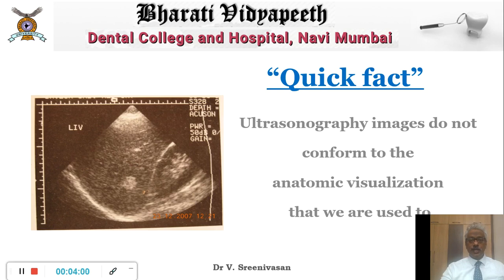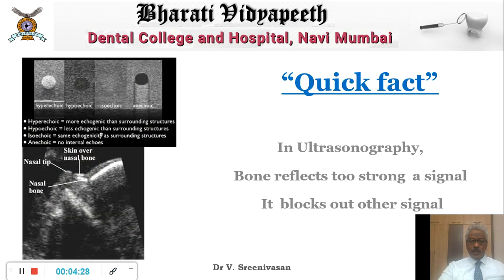Also, ultrasonography is one imaging modality which changed the terminology of radiography, because here we are not using radiation energy at all, which comes as a basic definition of radiology, but creating some form of energy to create an image. In that sense, again, it was a paradigm shift. So we've seen two or three paradigm shifts. Paradigm shift one, that the reflected images are seen. We saw that the transducers are both the generator of the sound as well as the recorder of the reflected sound. And third is that it does not look like anatomic images as such.